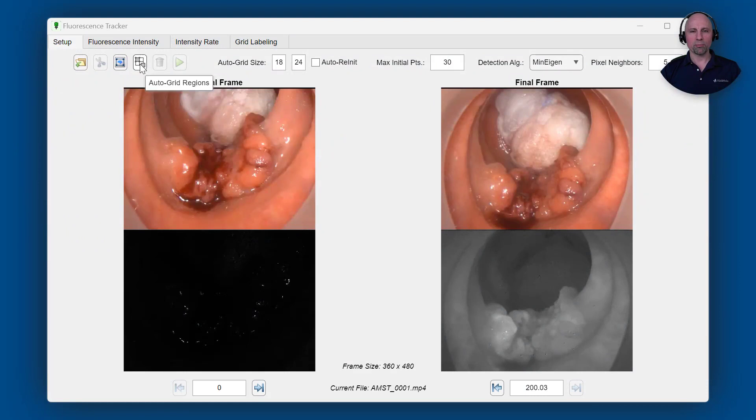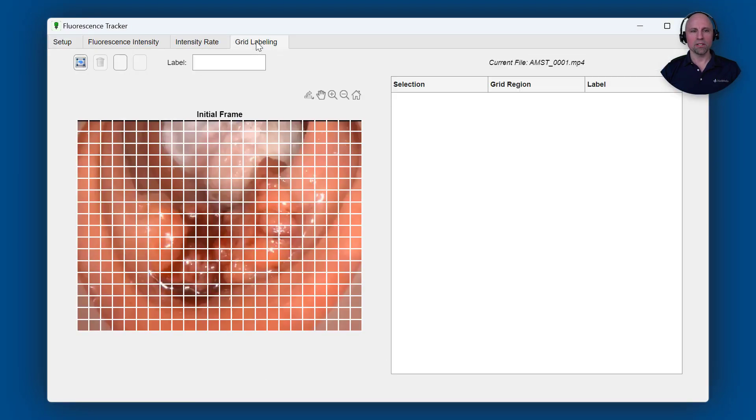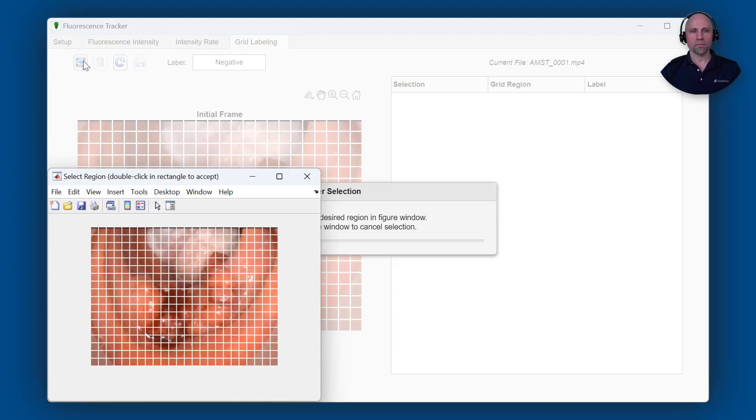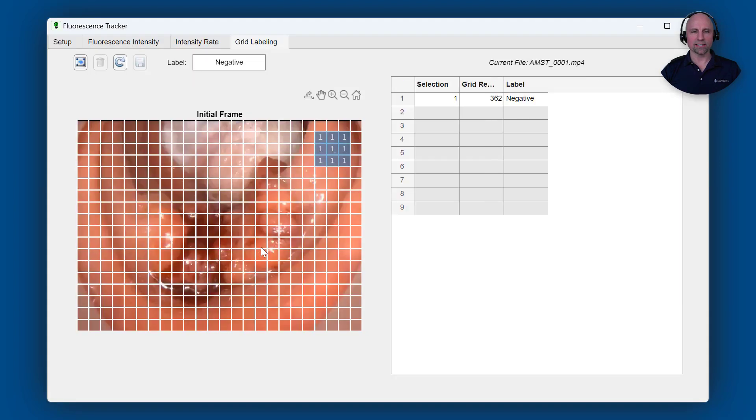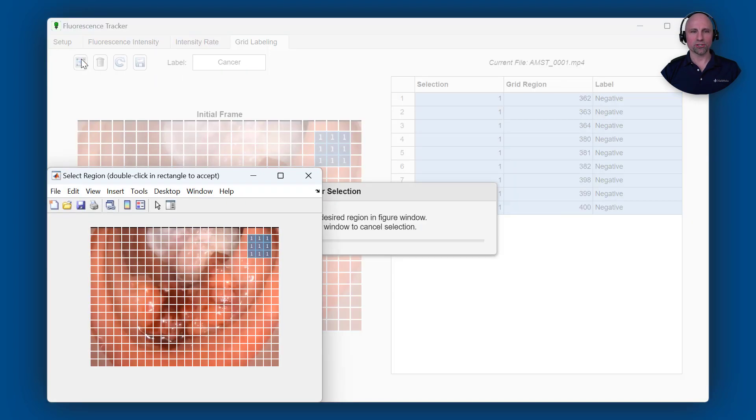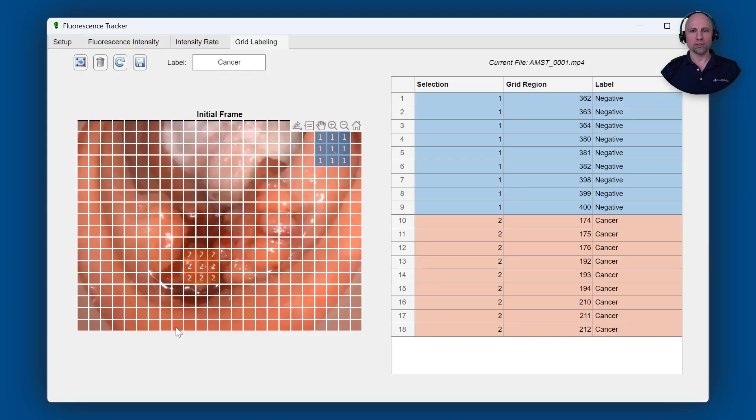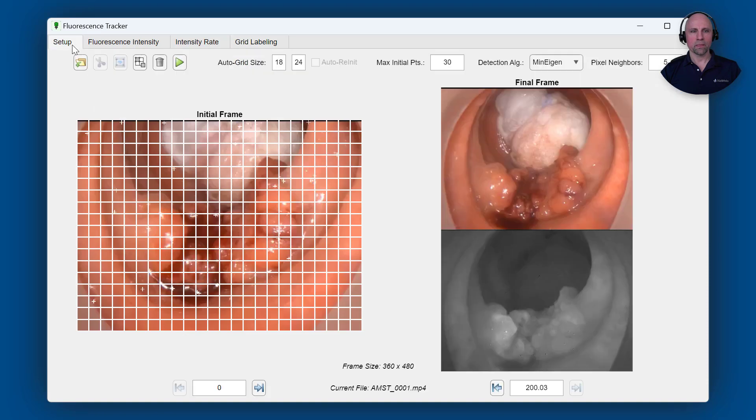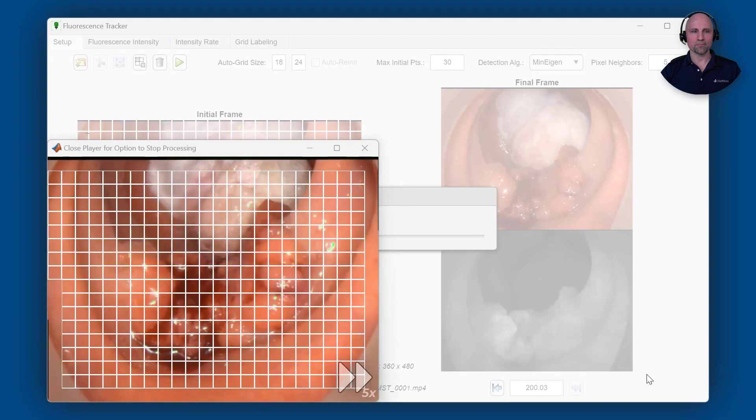You may recall from my previous how-to videos that this fluorescence imaging system simultaneously captures and displays videos in both the visible white light and near-infrared spectrums. The Fluorescence Tracker app you see here has been updated to easily extract and label intensity time histories across a grid of regions. Since we'll be using supervised learning to train our classifier, we'll need to label the known biopsy responses for each grid region used in our training and testing datasets. We'll then process the video to extract the fluorescence intensity time histories for each grid region.